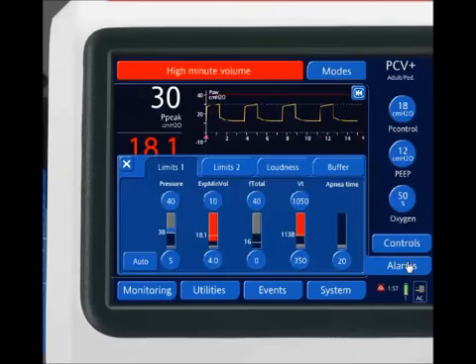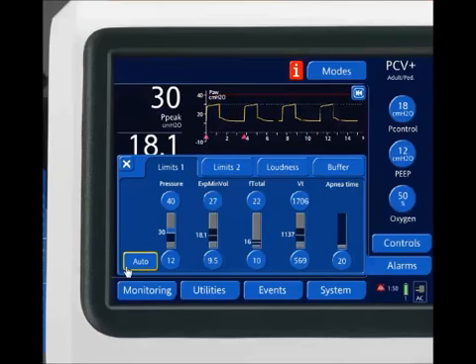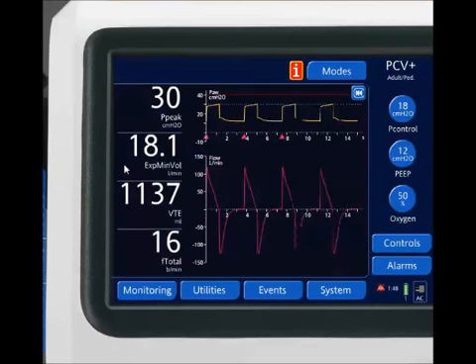And I'm going to just change my alarm thresholds here. Expiratory minute ventilation. Let's just increase all this up. There. We'll auto set it. As you notice, I have the same pressure control set of 18. It gives me the same peak inspiratory pressure. However, my tidal volume went up. It doubled. It went up to a liter. So they have a huge flow demand, flow increase.